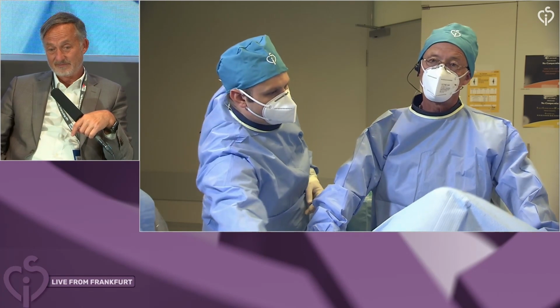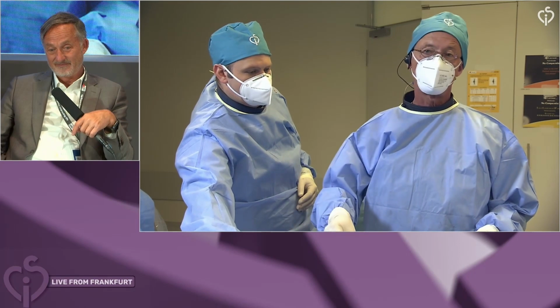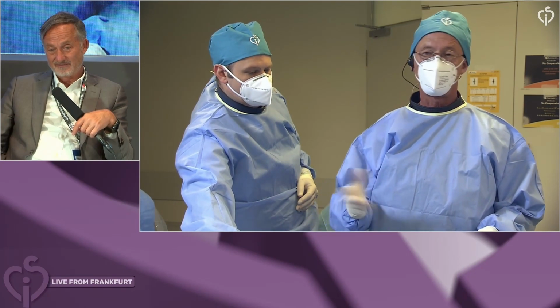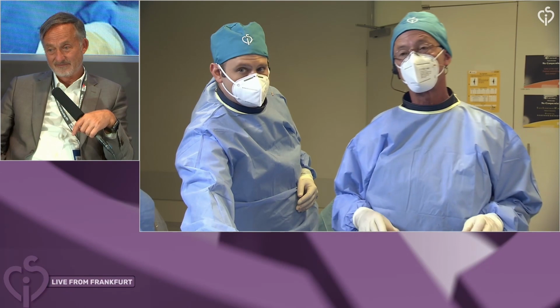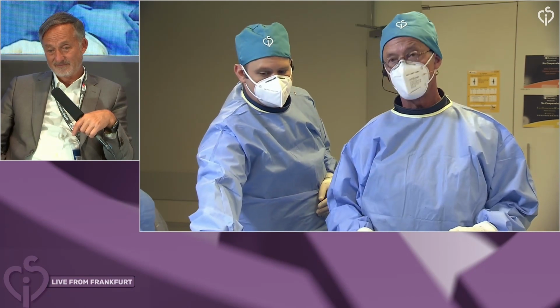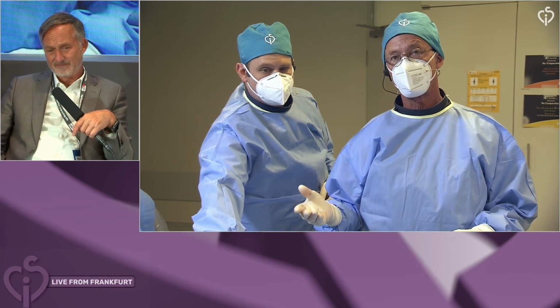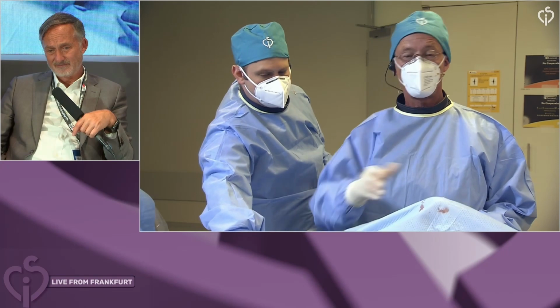This is one of the reasons why many are interested in resorbable devices, because then all this discussion goes away. I mean, there's also always a little bit, not so much with PFO closure, but with ASD closure. We have follow-up now of 25, 30 years, but not more than that. And we don't really know.